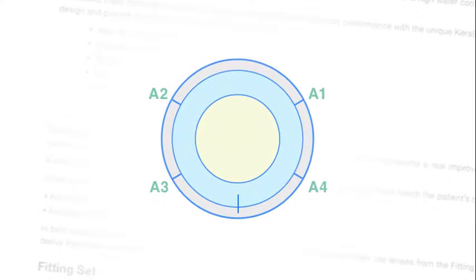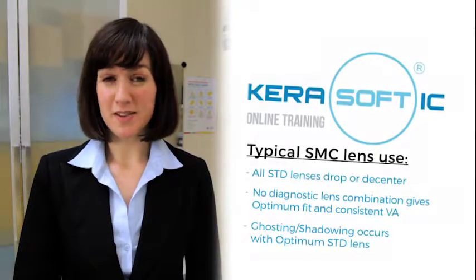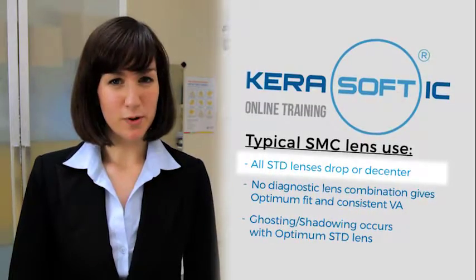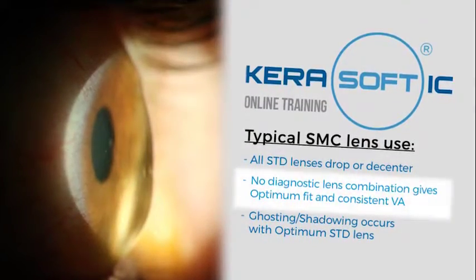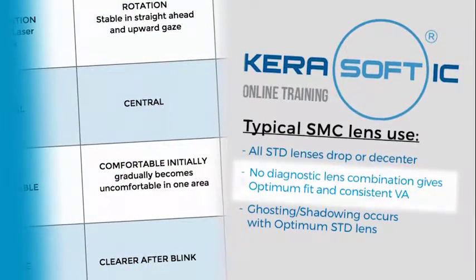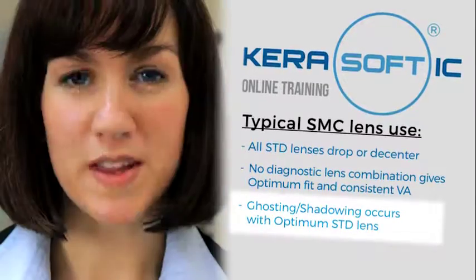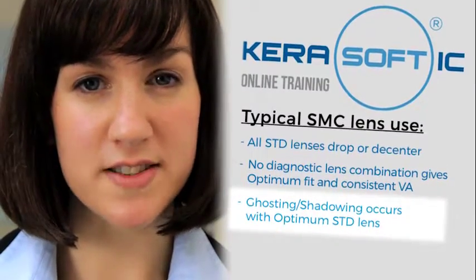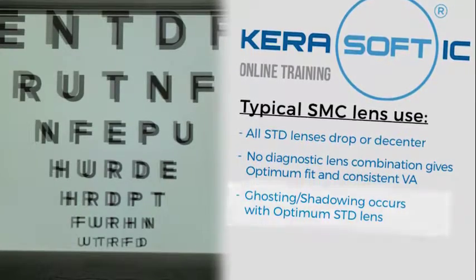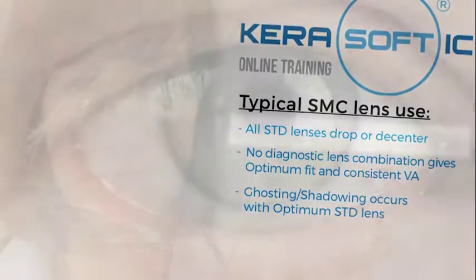Sector management control is typically used where all standard periphery lenses drop, regardless of the base curve tried, due to the curvature of the cornea, for example with pellucid marginal degeneration. No diagnostic lens can be found that gives consistent visual acuity and an optimal fit. Or the optimal fitting standard periphery lens consistently provides ghosting or shadowing of images. Let us look at the first scenario.